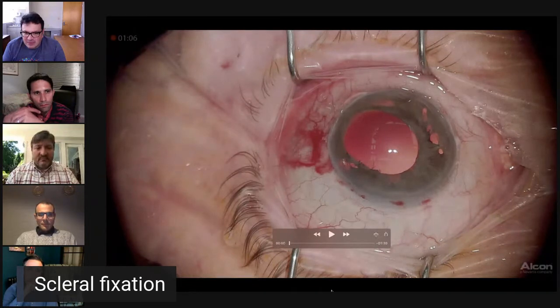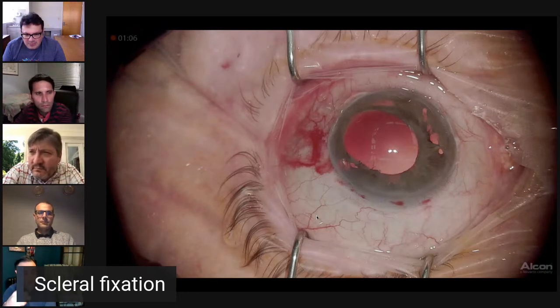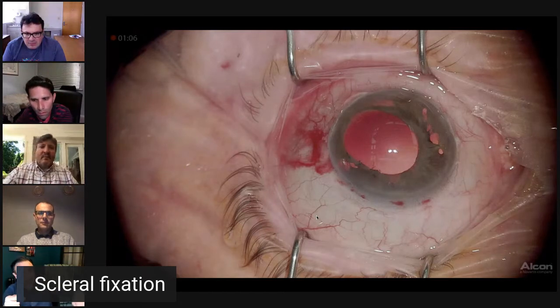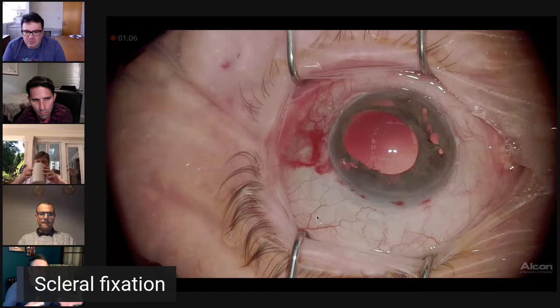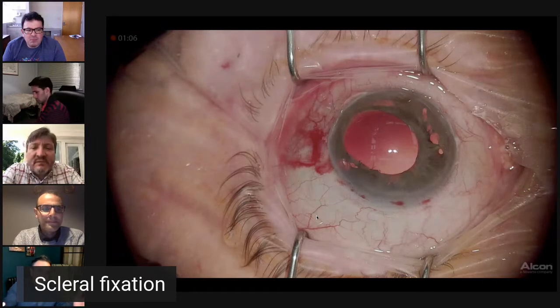Yes, I removed one, and that was quite a while ago. So where do you hold? Do you hold like I showed next to the? I'm talking about the posterior one. Basically, I picked it up with the artisan forceps, and I found it very easy. I just again went with the iris hook, went through the haptic, followed the loop until I found the gap and disengaged. I thought it was going to be horrendously difficult. I've done only one case and it went very easy. I don't know if I anchor it in a different way, if it's going to be that easy, but I found it very, very easy.